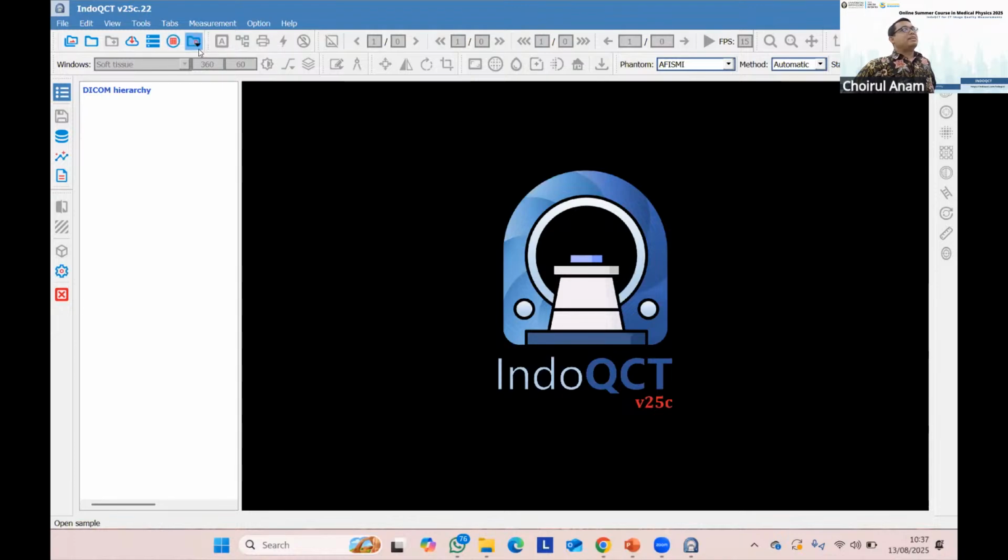And this one is the button for opening the samples. So the IndoQCT has many samples. For educational purposes, you don't need your own images. You can use these sample images.